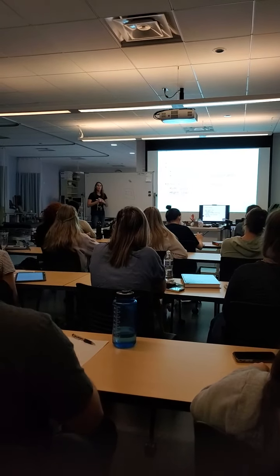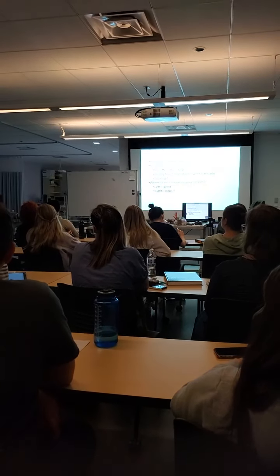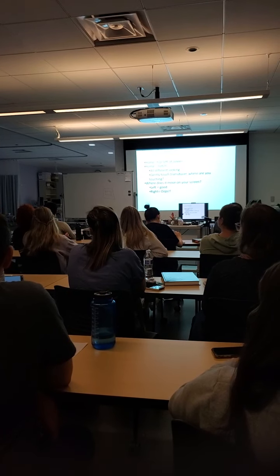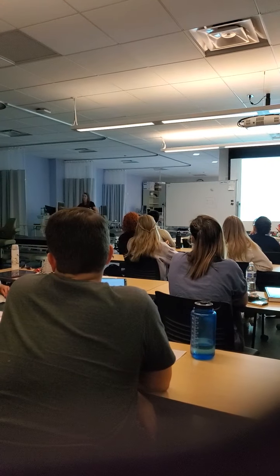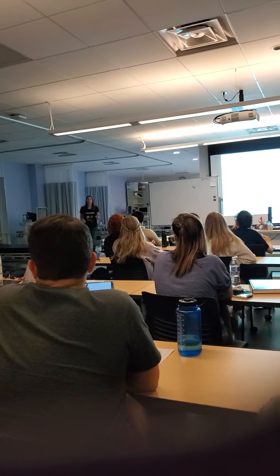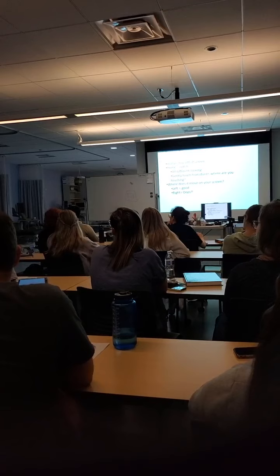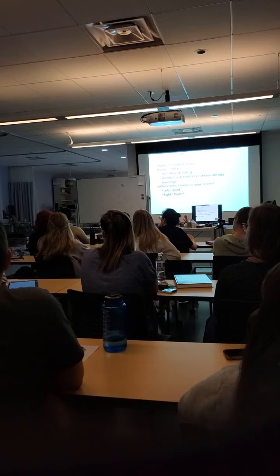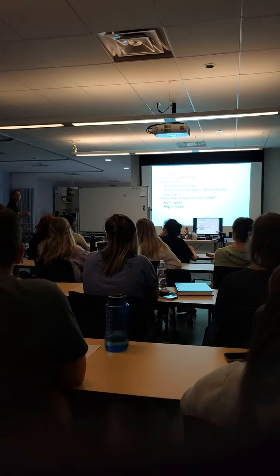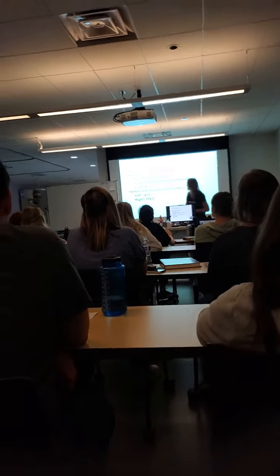So if you're ever like, I don't know which way this probe is, pet the portion on your probe with the notch on it, and it should be on this side of the screen. It should be on the patient's right, real people, normal people left. And I do not know my right and left very well, so this is the way I remember. My patient's laying right here, so the side closest to me is my patient's right. And we'll talk about that with lab too, because you'll be like, I don't know what I'm doing. And okay, so yeah, if you touch that little portion, it should go on the left side.